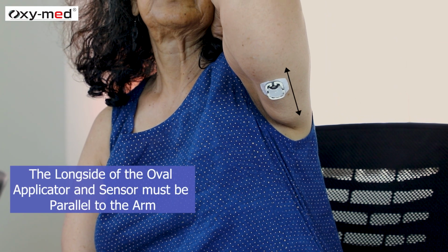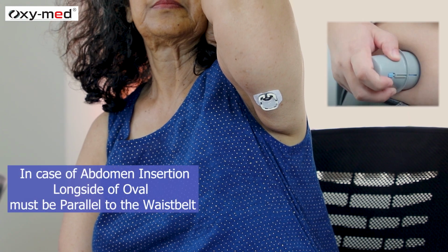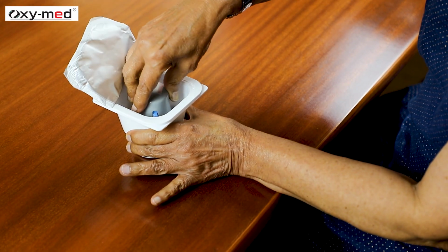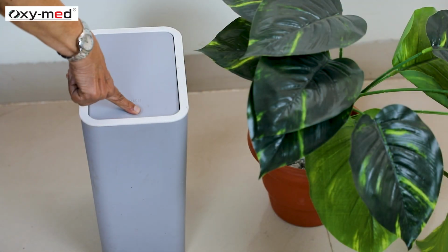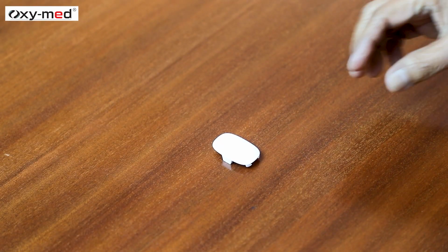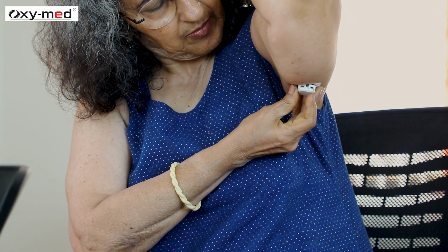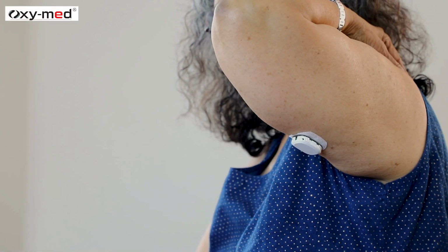The long side of the oval applicator and sensor must be parallel to the arm. In case of abdomen insertion, the long side of the oval must be parallel to the waist belt. Discard the used applicator. Match the orientation and then snap the transmitter into the sensor holder. Make sure this snap hook is engaged before pressing the other side.